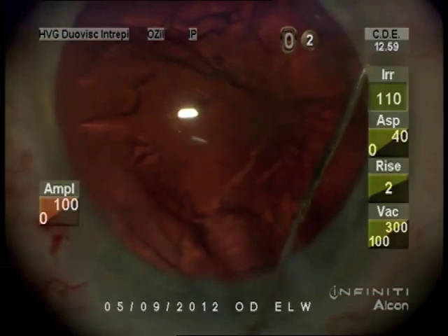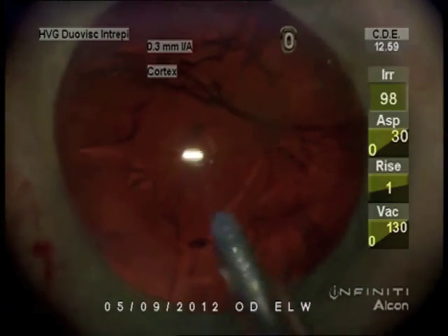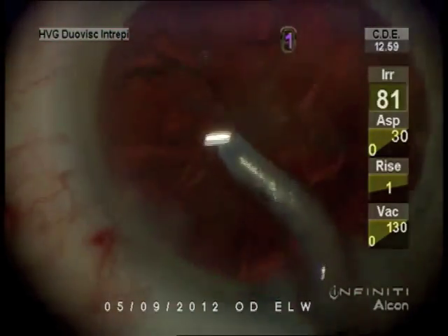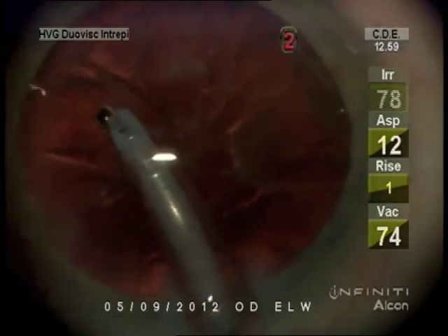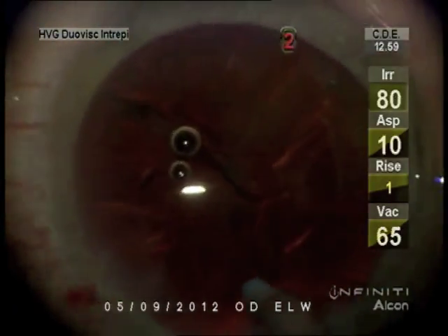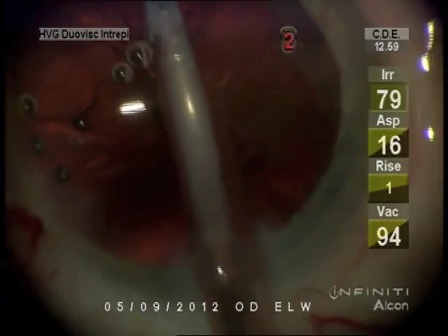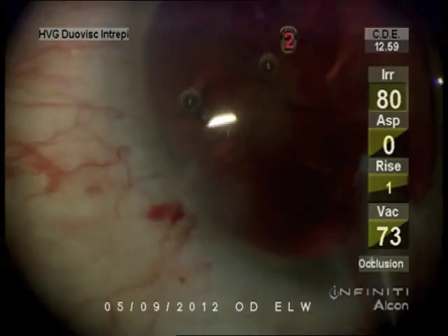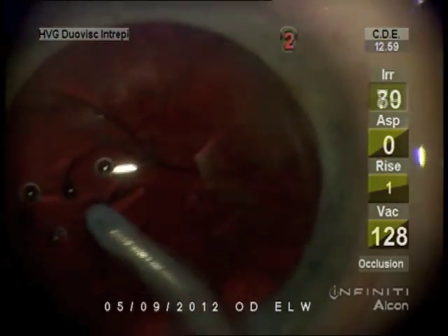Might sting a little bit here. More lidocaine while she's changing tubing to IA. I have two settings for IA. Lower vacuum, so I can titrate better to get this subincisional cortex, and I always start with it. IA1 now.